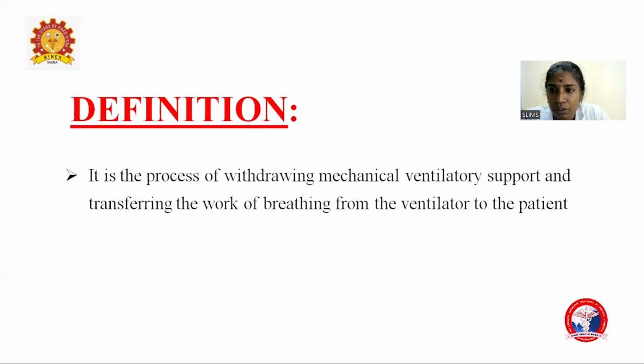So what is the definition of weaning? It is the process of withdrawing the mechanical ventilatory support and transferring the work of breathing from the ventilator to the patient. So the patient takes his own breath automatically. In the last class we saw the ventilator giving the breath to the patient, and in weaning, the patient has to take his own breath.